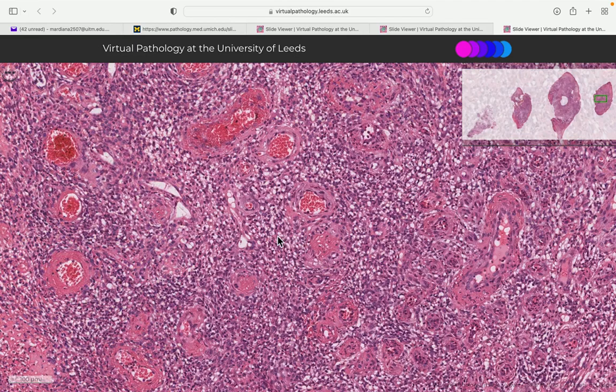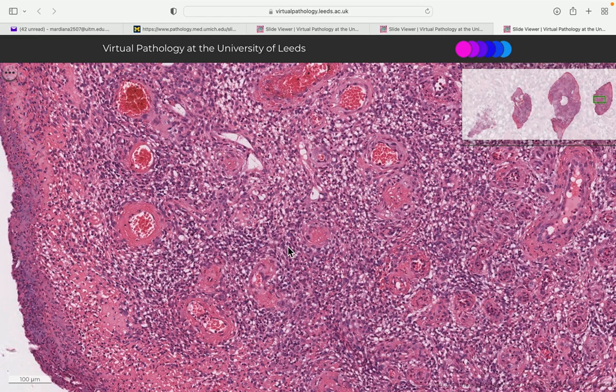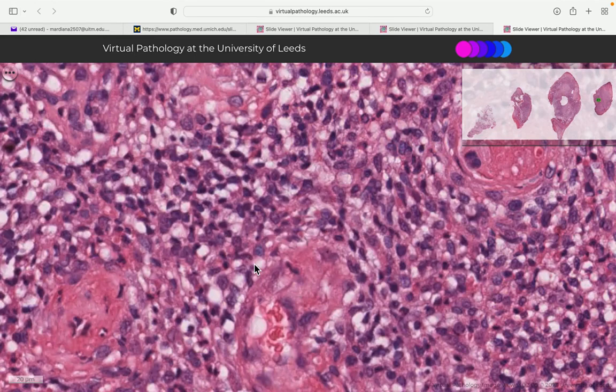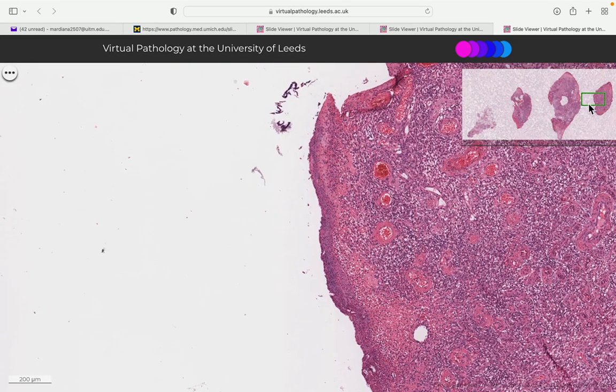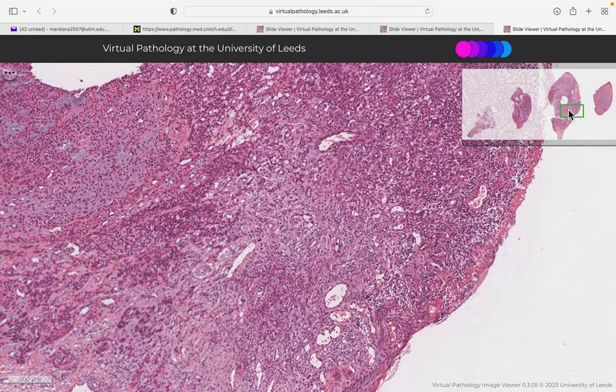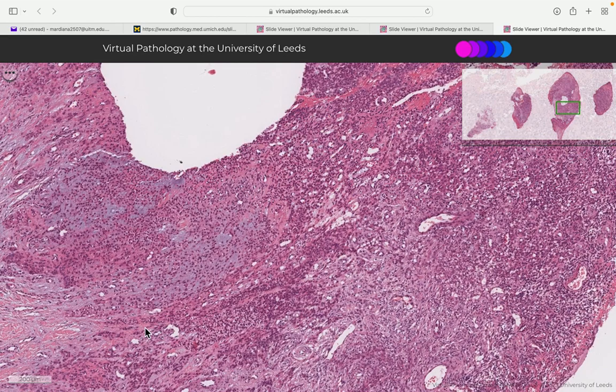and there might be coexisting inflammation at the same time. In this case, in between the blood vessels, you may be able to see all these inflammatory cells. On top of finding inflammatory cells, you will also find another population called fibroblasts.